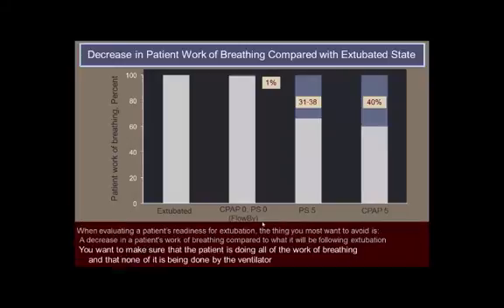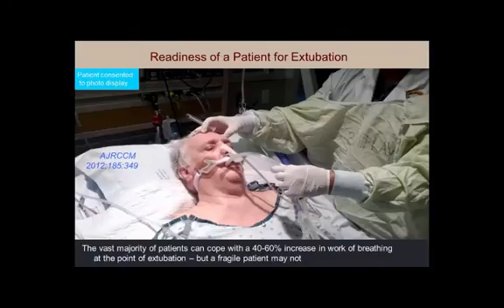Okay. What you want to make sure of is that the patient will be doing all of the work of breathing and that none of the work of breathing will be done by the ventilator. And obviously the only way to make sure that that happens is to make sure your pressure support is set at 0 and your PEEP is set at 0.